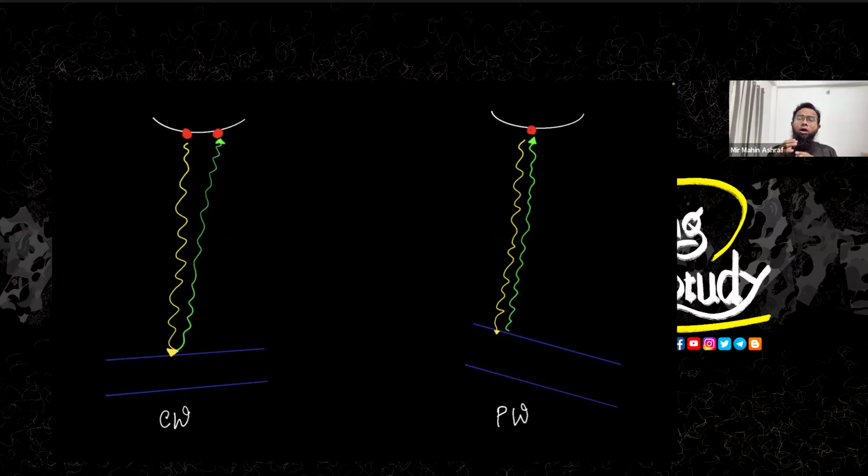As two people are working here, they can detect high velocity flows with continuous wave Doppler. But in pulse wave Doppler, a single person is working, so the workload is very hard for this person. So they can't actually detect high velocity flow. If you need high velocity flow detection, you will use the continuous wave Doppler.